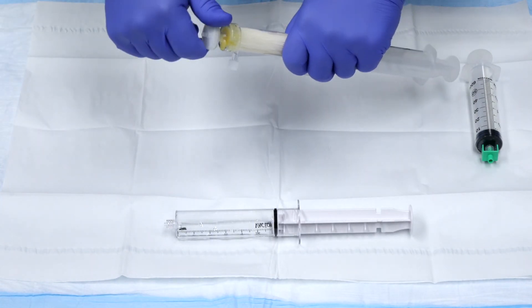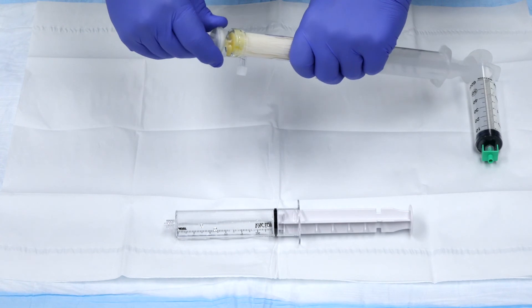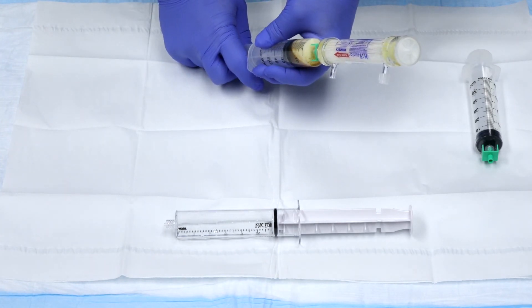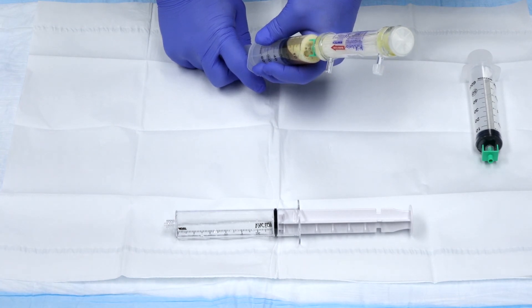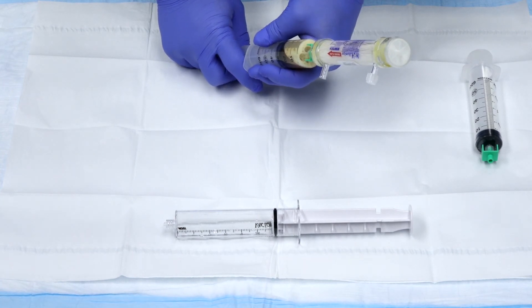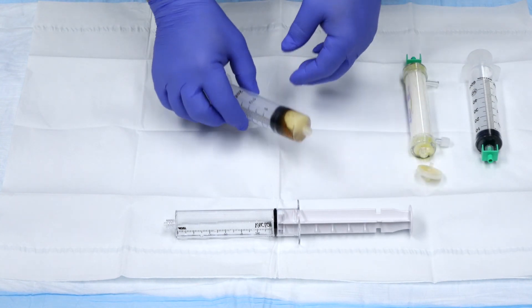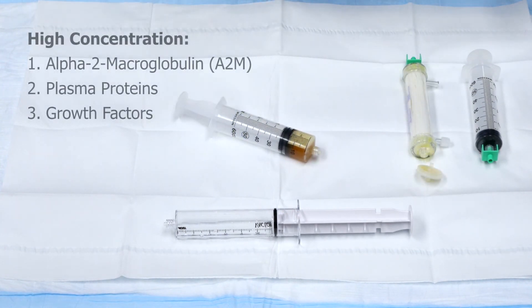Attach the filter to the open port and aspirate the remaining plasma from the concentration filter. You now have a high concentration of A2M proteins and growth factors.